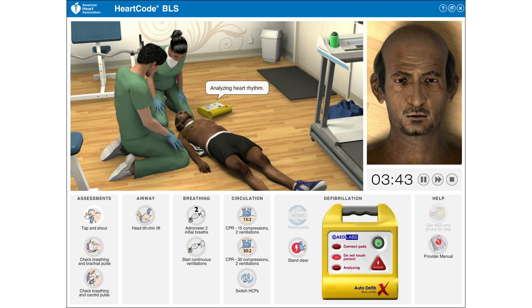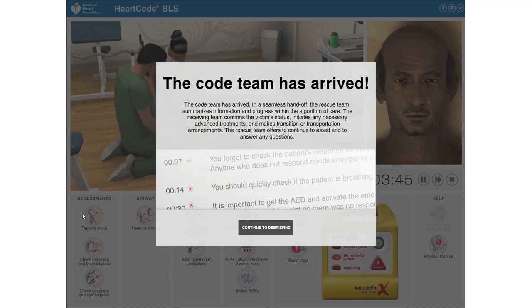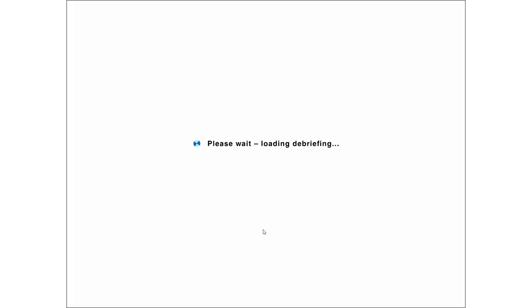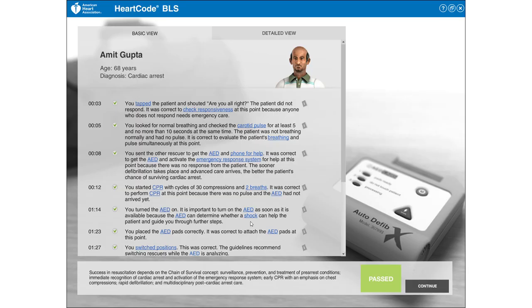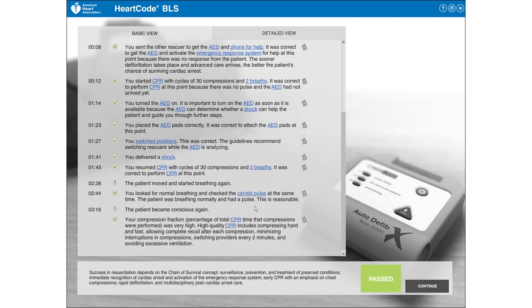Analyzing heart rhythm. Do not touch the patient. Do not touch the patient.